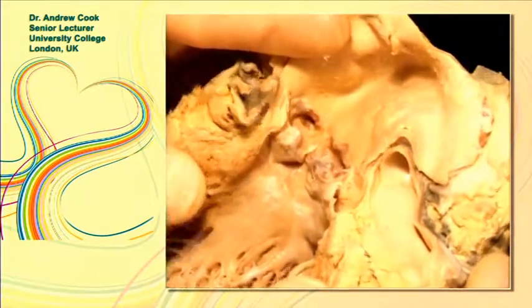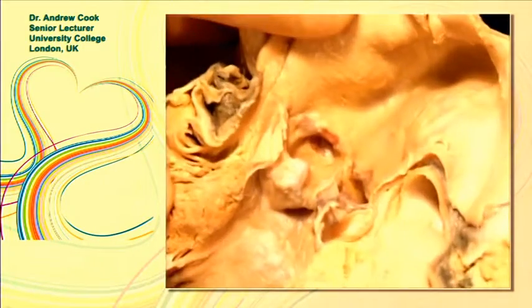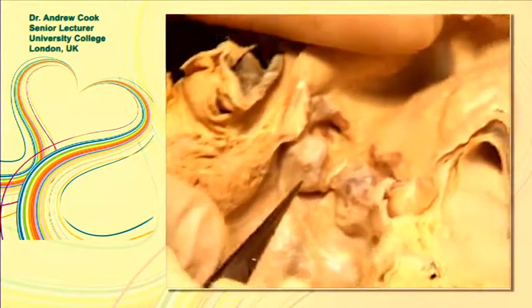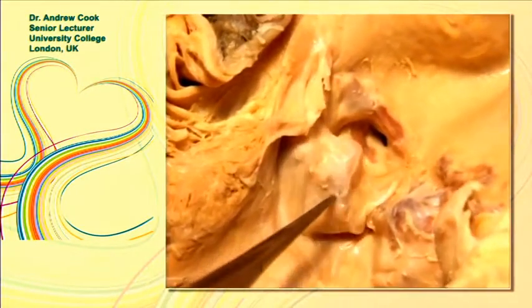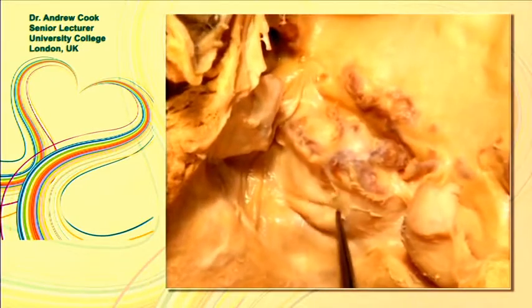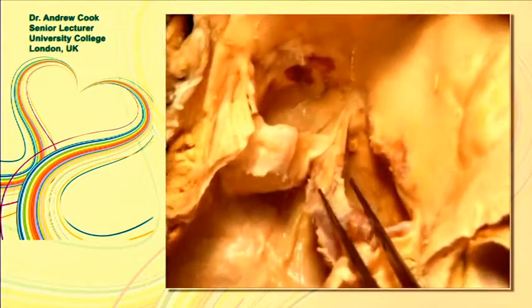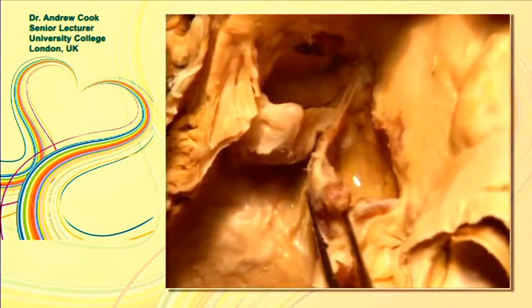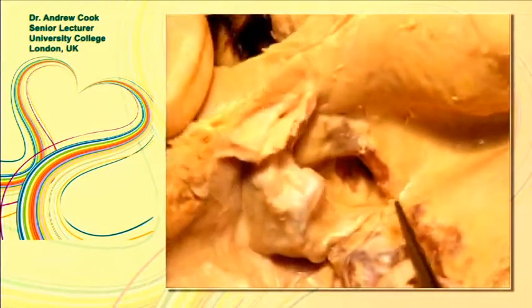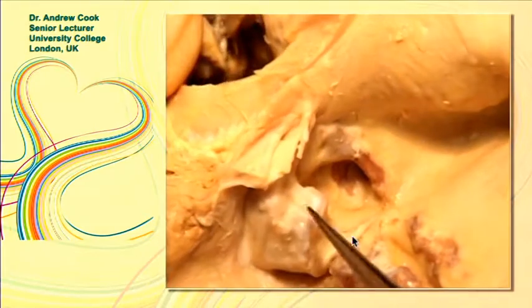Some other examples of stenotic valves. This is quite a trifoliate aortic valve stenosis. There's calcification of the leaflets and also the sinuses, but the calcification really is only of the leading edge of the leaflets, if you like, only of half of the leaflets. The base here is really normal and quite mobile. So I think these leaflets could still fall back into the sinuses, be pushed back by the TAVI quite adequately. And there you can see the calcification extending around the right coronary artery.